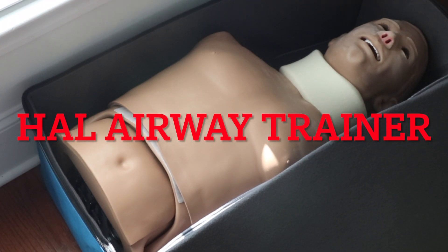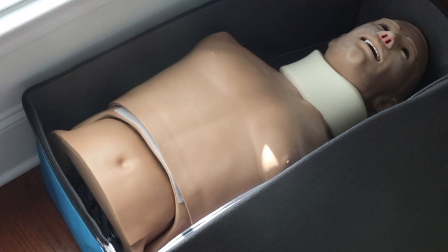Hello and welcome to the HAL Airway Trainer video for Beaufort County Community College. We're going to go over a couple things that we're going to be using this mannequin for in the different classes at the community college. It's primarily an airway trainer, but it can also be used in CPR scenarios.